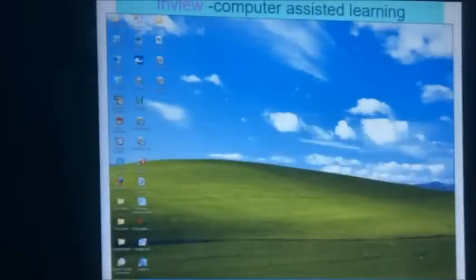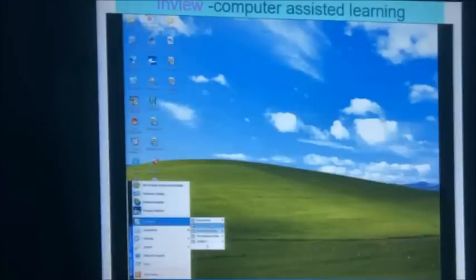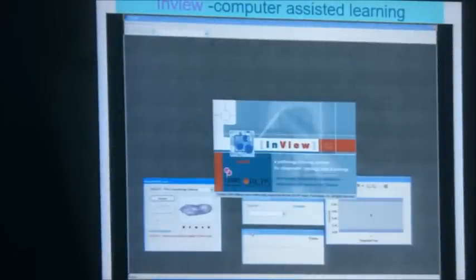This is a video to show you. This is just a computer. You have the DVD put in this computer. You open it this way, okay? So you open that, okay? And then what's called in view, okay? Like say we have breast, we have cervical, we have gynae, different. So you go now, you choose whatever thing you want to see. So this is, for example, cervical biopsies. And then you choose one slide, one of these virtual slides.